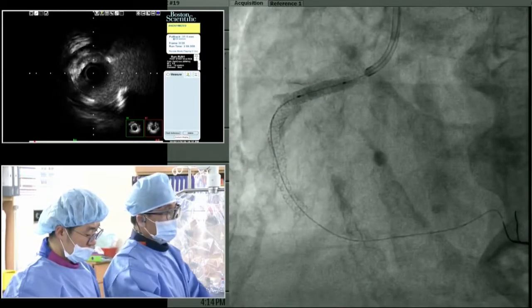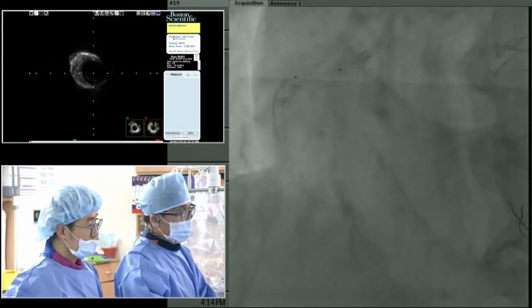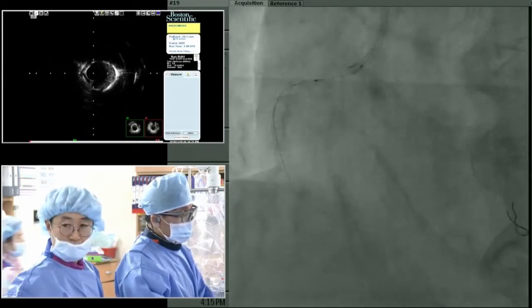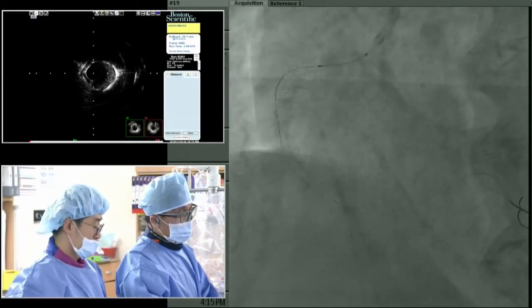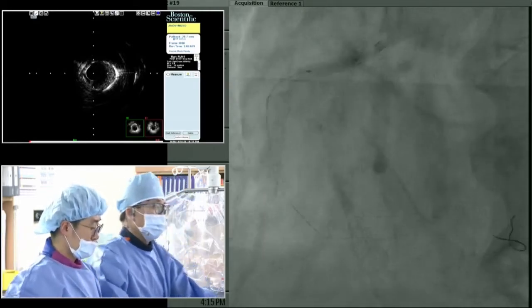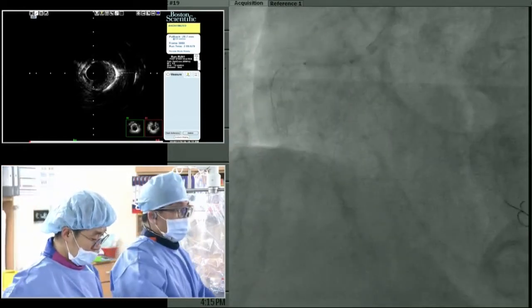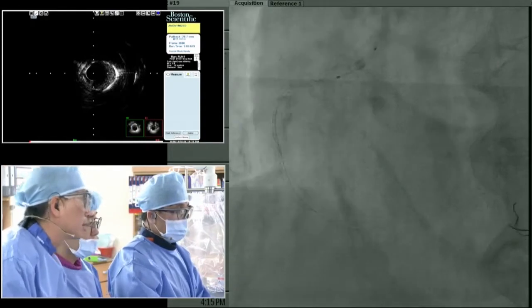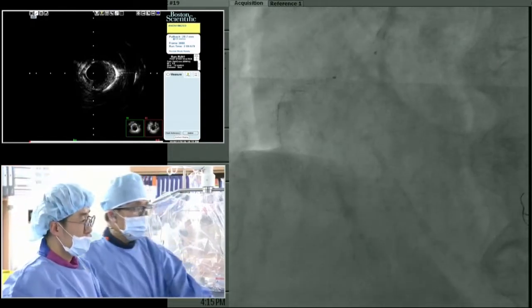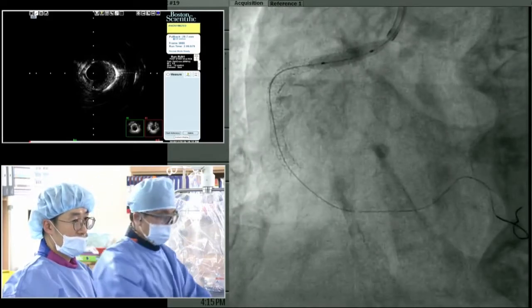Okay, patient. I think I have to come out a little bit, a little bit more. Yes. High pressure 20, 25. Okay, 20. 20, 25. Make a full balloon. 25. Deflation. A little bit more. It came out a bit more. Okay. Let's go. 25. Good. Deflation.